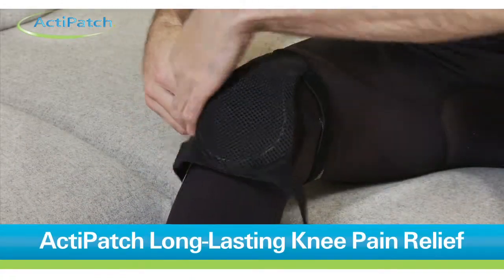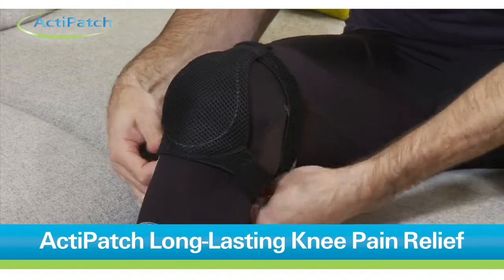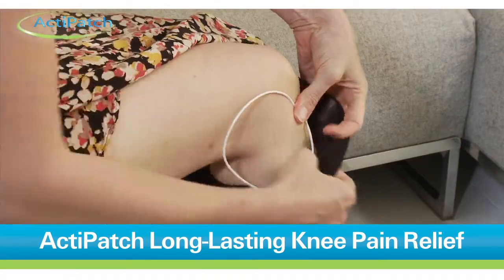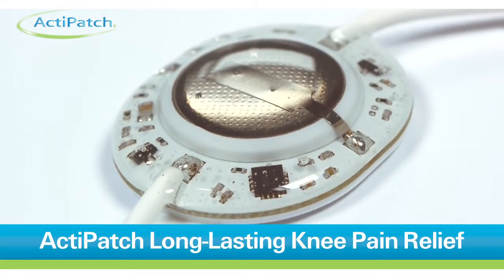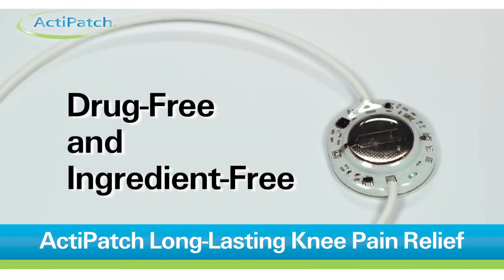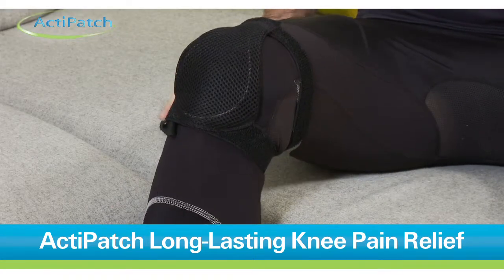Simply place the ActiPatch device loop directly over the source of the pain using the supplied knee wrap or any other method you're comfortable with, and wear continuously until the pain diminishes. The ActiPatch pain relief device is drug and ingredient free, so it is safe for continuous use and can be used while taking any other medication.